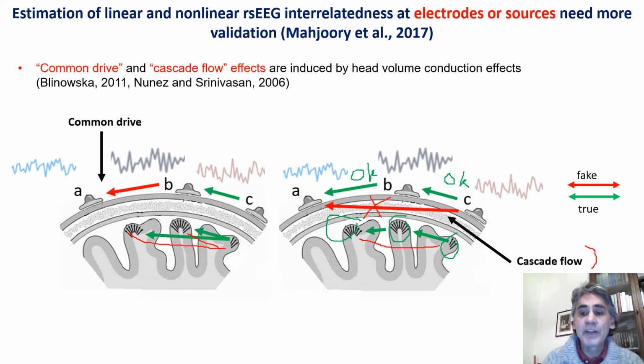So the use of all these techniques needs more validation and more consensus about the best procedure to estimate the functional connectivity from resting state EEG activity.